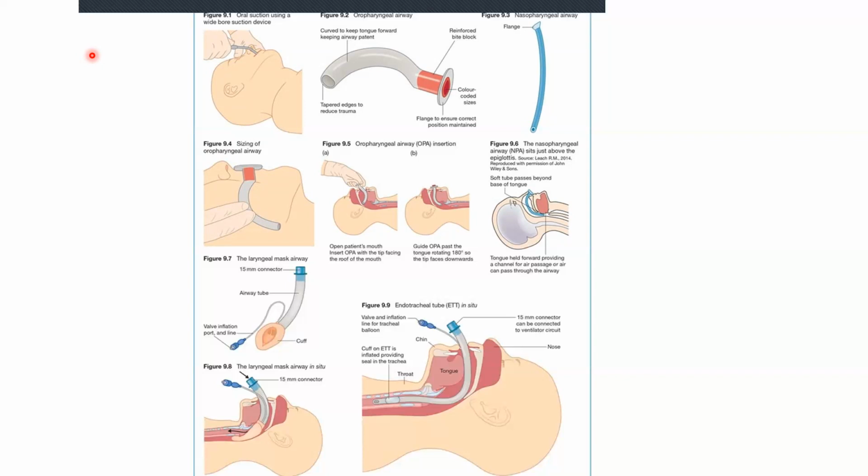Sebab apa? At the same time you nak tengok lambat kau nak buat airway maneuver sampai 3 jam, nak dia buat CT brain, lah mana ada. Nak kena intubate ke apa, betul tak? So I buat suction, I check dia punya gag. Okay, so now tak ada gag, letak OPA. So put in the OPA. Tadi kita dah tunjuk measure the size and all that. Kalau ada gag, you pasang nasopharyngeal airway. Okay, so lepas tu letak apa kat patient?